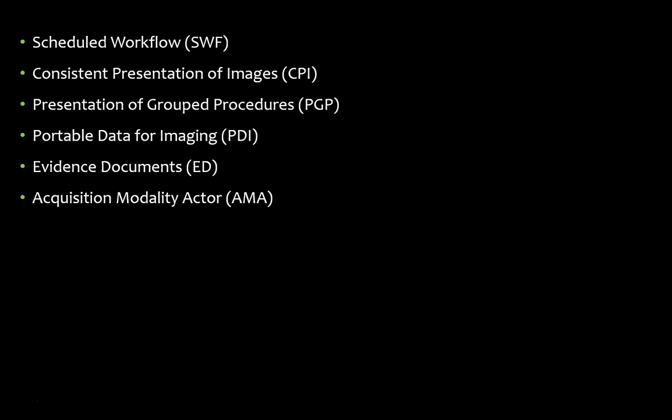Acquisition modality is the key role played by a modality system. It defines how it sends images and receives modality worklists. So those are the profiles to consider when planning to purchase a new modality.